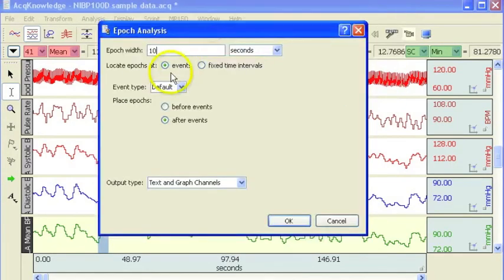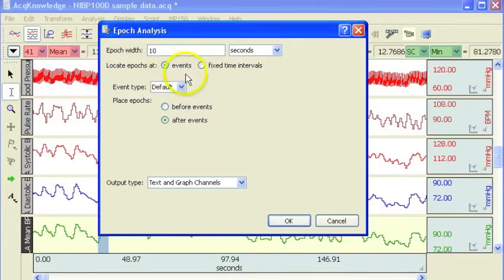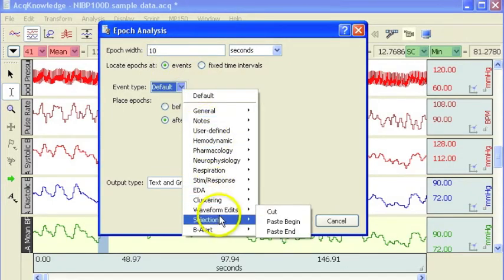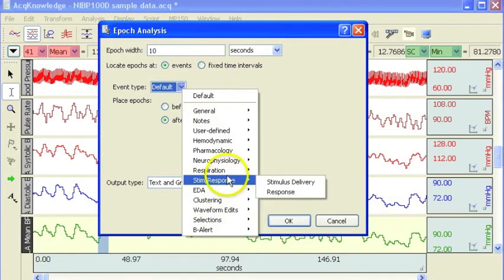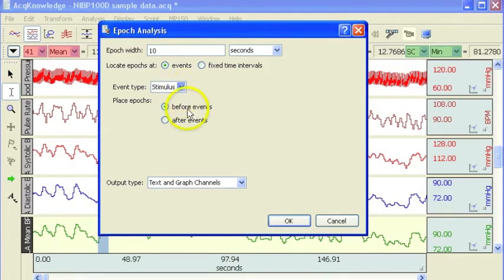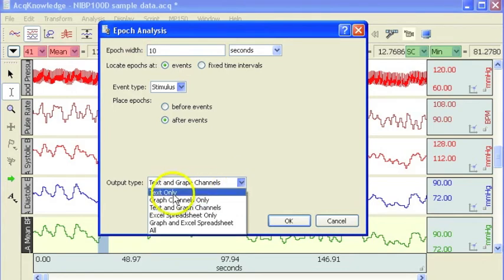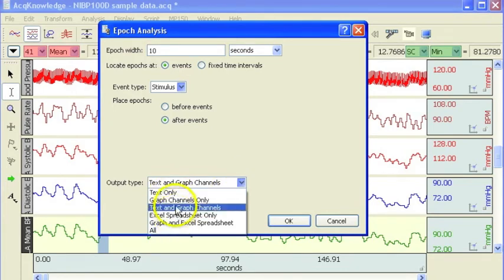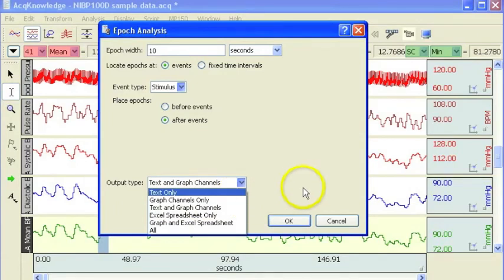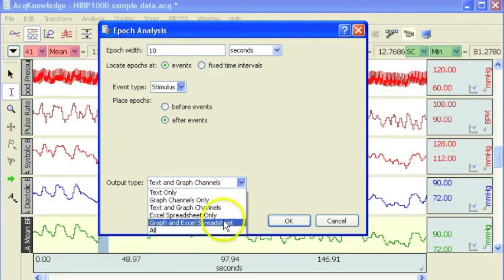there's also an option here to trigger the measurements from events in the recording. So these events could be digital marks that are coming from SuperLab or E-Prime, in which case you need to look up the type of event. If it was a stimulus, it goes in there, and then we can say we want to take our measurement before the event mark or after the event mark. And then select whether we want to paste into the journal or a spreadsheet or whether we want to graph the measurements as new channels or whether we want to do both.